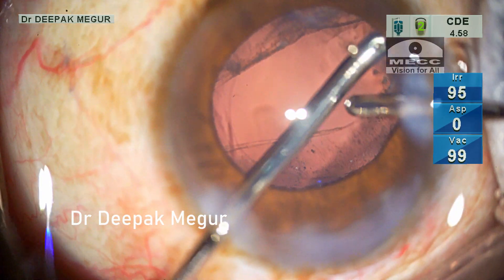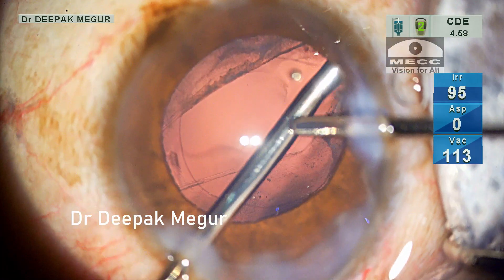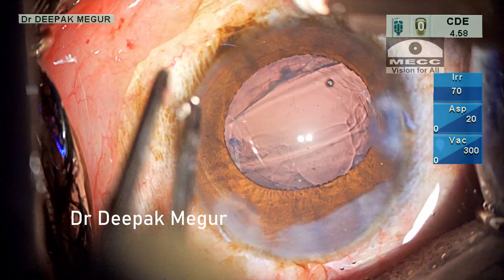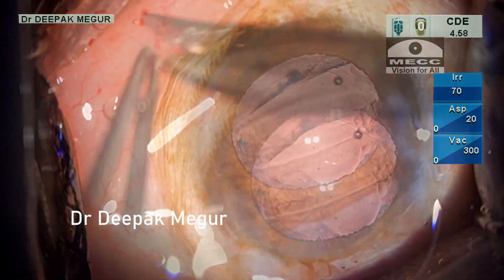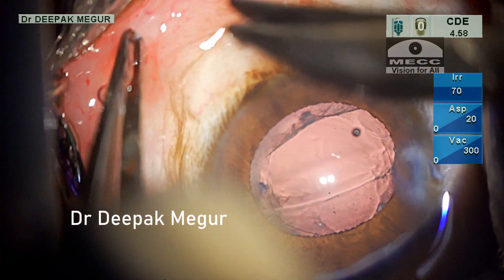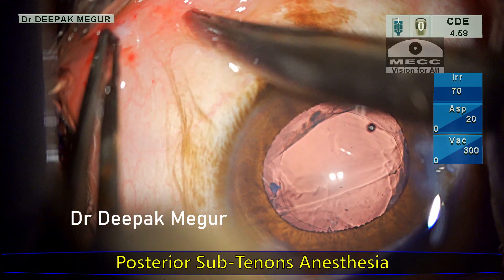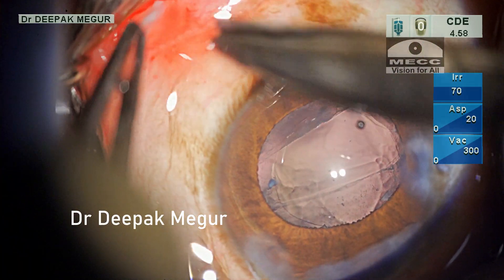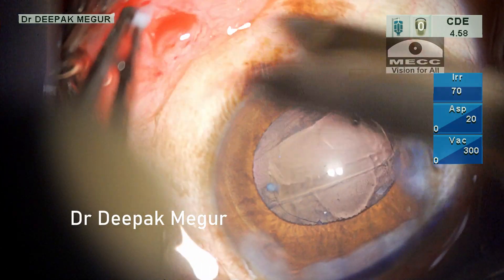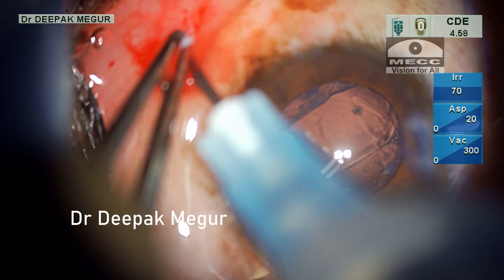At this moment I realize that the patient is uncomfortable and is complaining of pain. Remember, we are performing the surgery under topical anesthesia. So I inject sub-conjunctival lignocaine and make a small conjunctival opening in the inferior medial quadrant. Then, using a 23G cannula, I inject 1 ml of lignocaine into the posterior sub-Tenon's space. This will ensure the patient's comfort and allow us to do a tidy job.